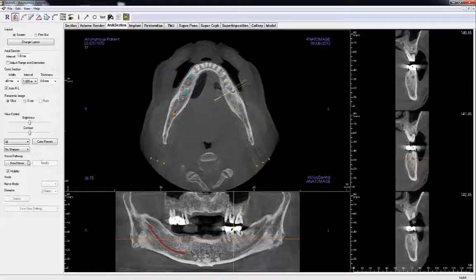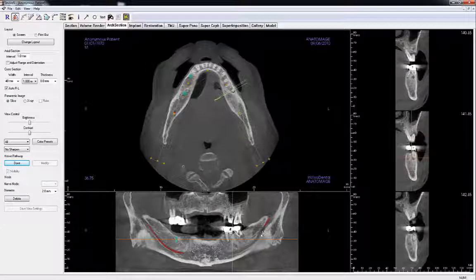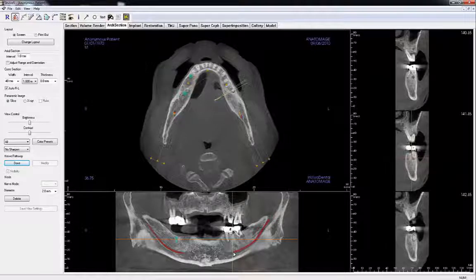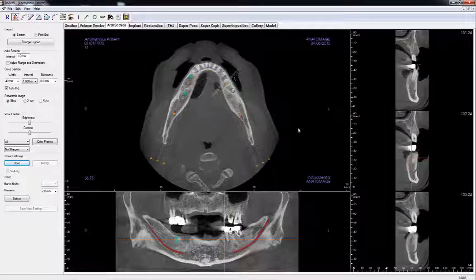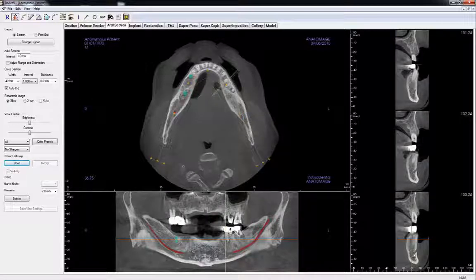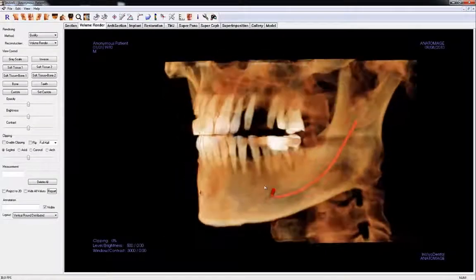Next, to trace the nerve, click New Nerve. Use the pano panel to place points along the nerve canal. Before placing the second to last point, move the green lines to the mental foramen by referring to the cross-sections. On the cross-section, place the second to last point on the inside and the last point on the outside for the nerve to exit. Right click to finish. Here is the nerve we have just traced.